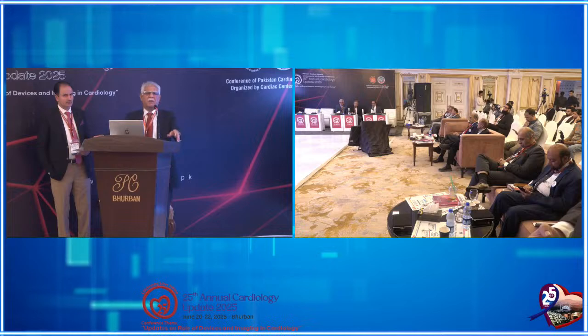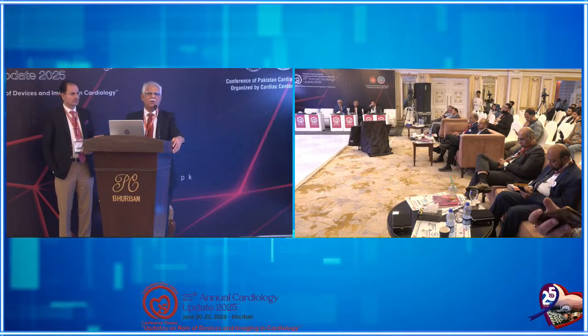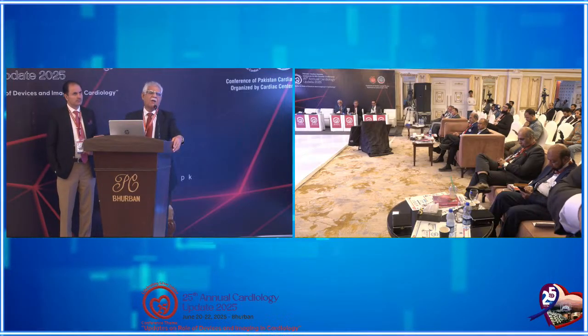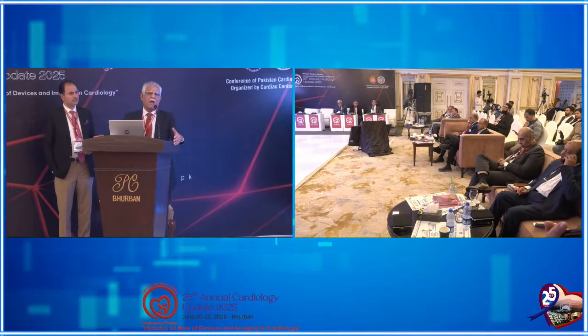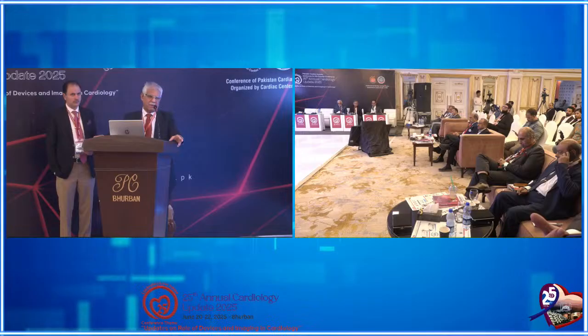But just today, one tech from one center called me after doing coronary calcium and said that the coronary calcium is about 1200. So I asked him to send the patient back to the consultant and tell him that the information provided would be very limited.